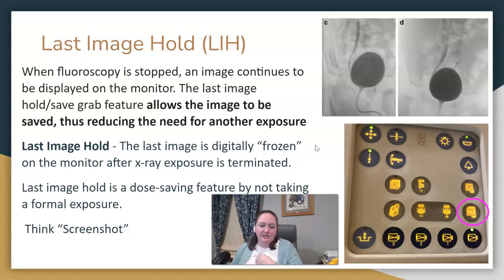Here's an image of our fluoro machine. The shot save options on it are what last image hold would be. For pediatrics, we use it quite a lot, but it is sometimes not as good quality as a formal exposure. They weigh their options, and for pediatrics we can usually use last image hold to reduce dose.